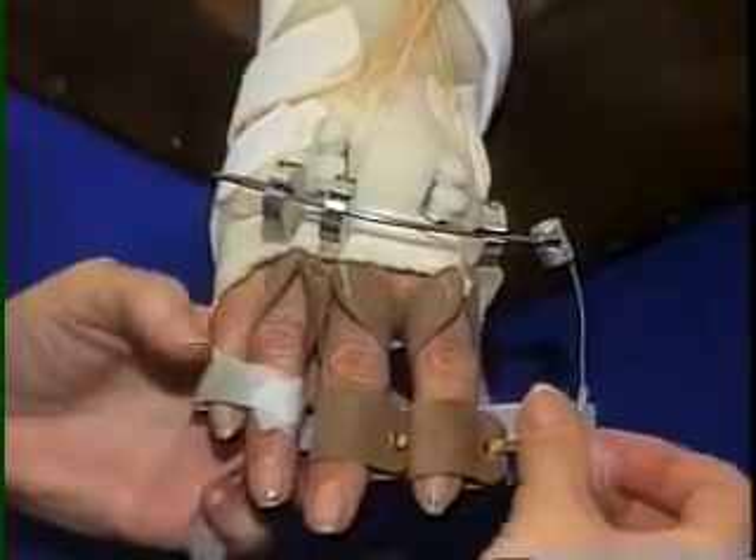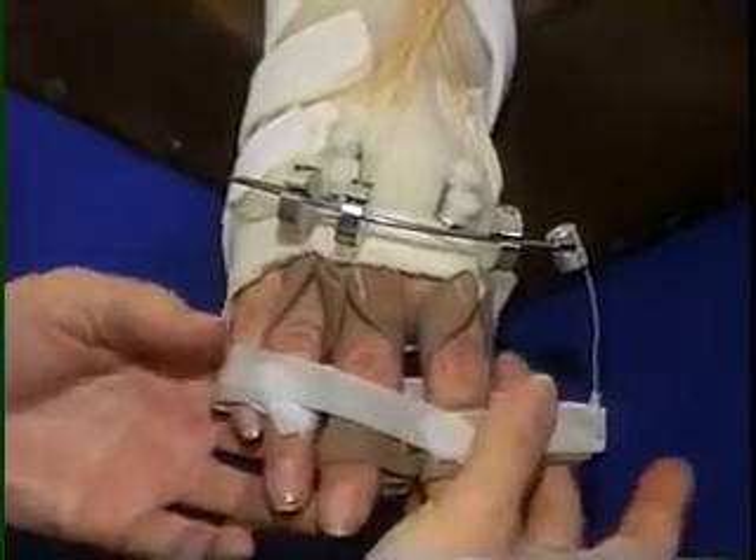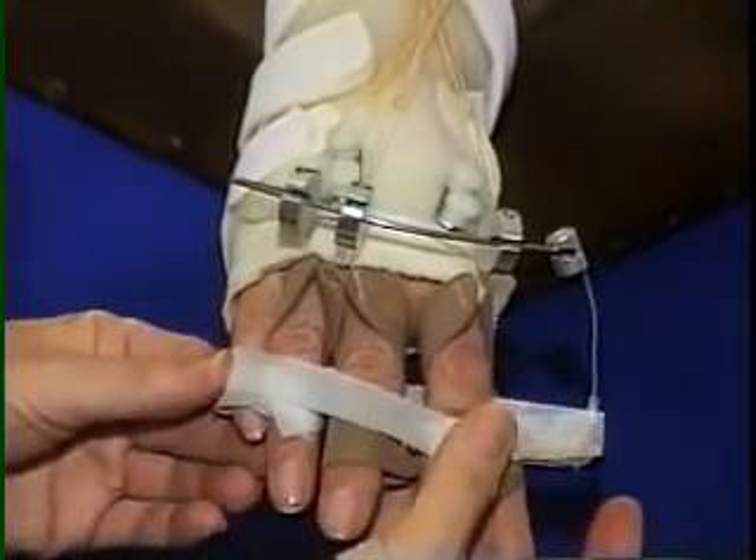Paper tape may be placed around all four fingers for additional lateral stability. Some therapists prefer taping only the ring and little fingers.